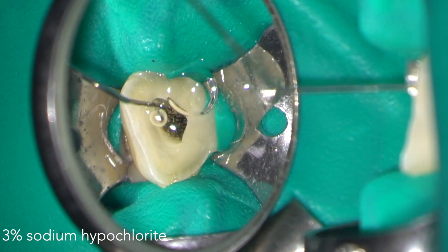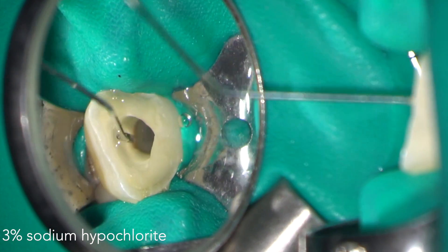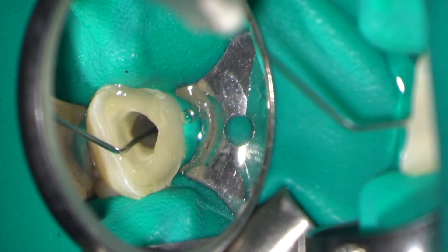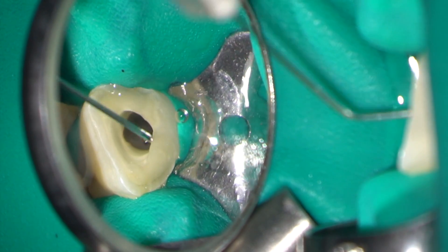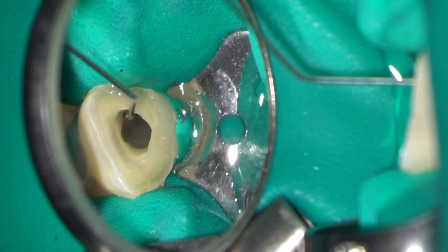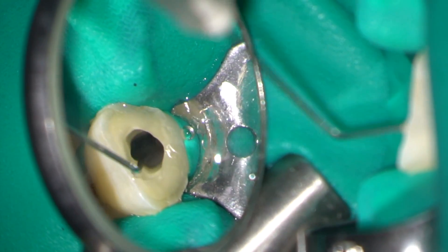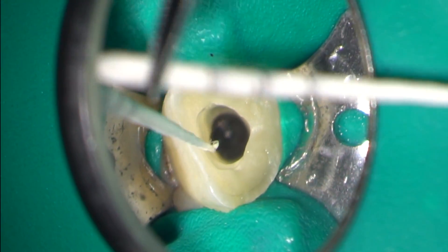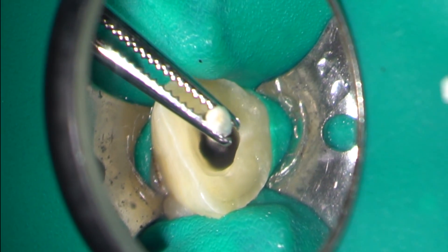No preparation was required in this case. Instead the root canal was disinfected thoroughly with 3% sodium hypochlorite and 17% EDTA. The solutions were agitated with an endo activator. After irrigation the canals were dried using sterile large paper points.